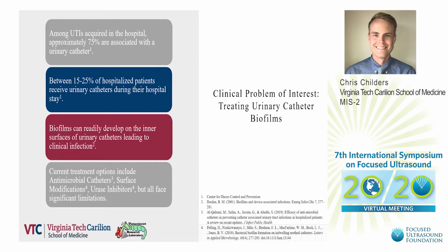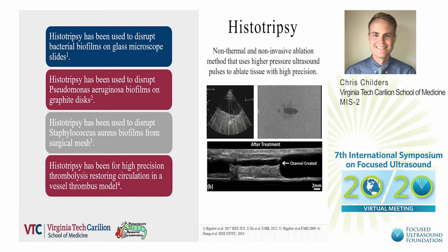Current treatments include antimicrobial catheters, surface modifications to catheters, and urease inhibitors, but all of these face significant limitations such as antibiotic resistance, limited efficacy, and use of systemic drugs. Histotripsy is a non-thermal, non-invasive ablation method that uses high-pressure ultrasound pulses to ablate tissue with high precision.